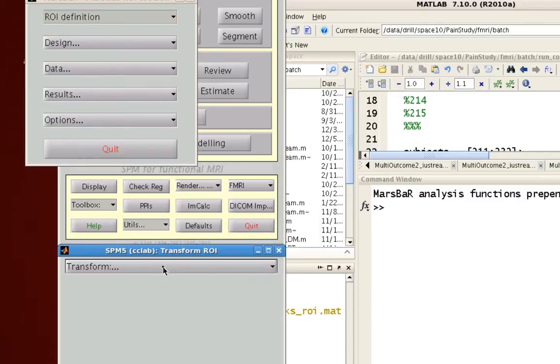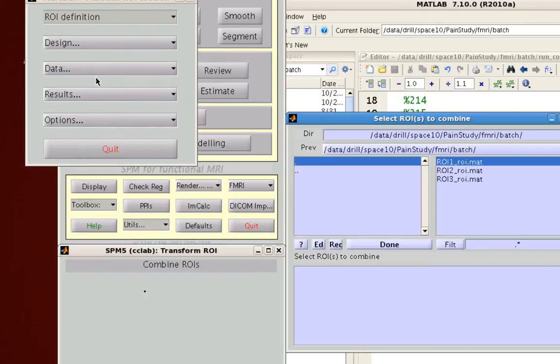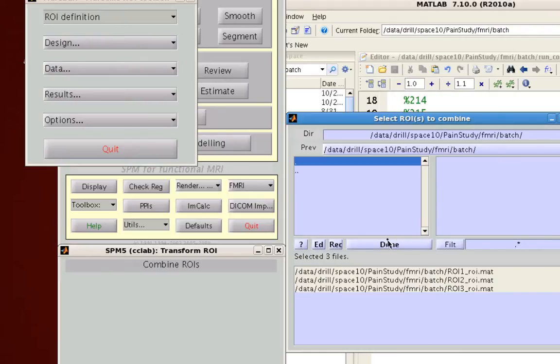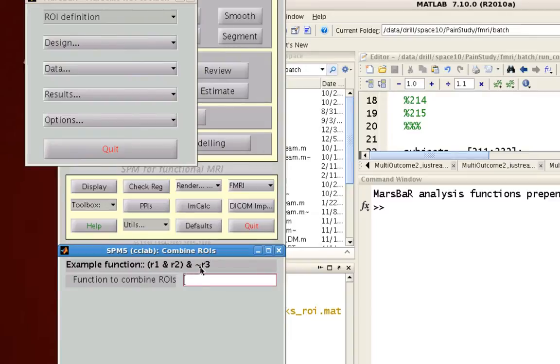Go to transform and then select combine ROIs and select all the ROIs that you want to combine. You want to take all three, and notice here that when it wants you to combine the ROIs, R1, R2, R3 correspond to the number of ROIs you have. They're reserved keywords in this case.